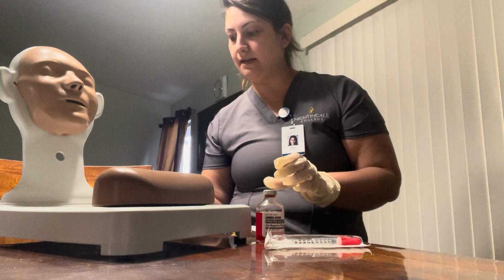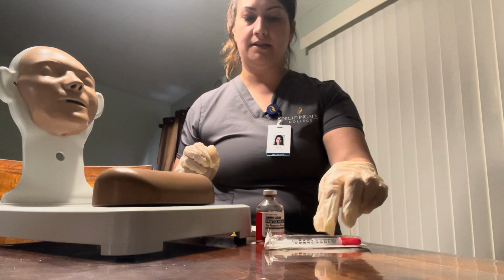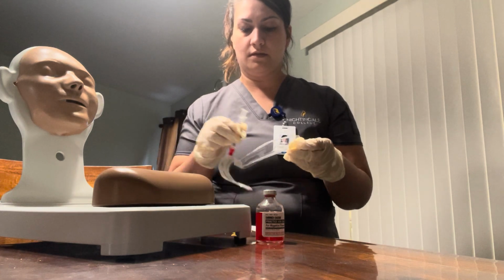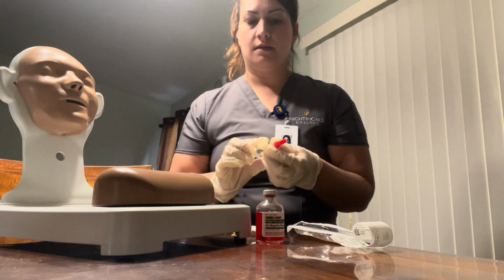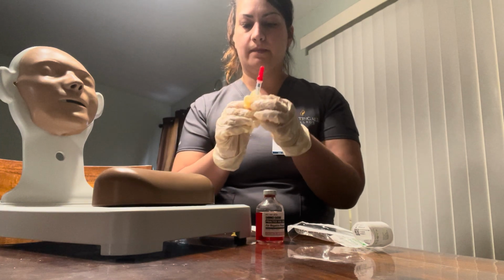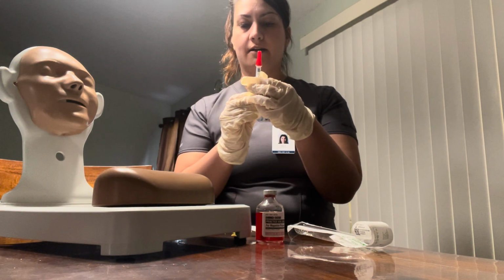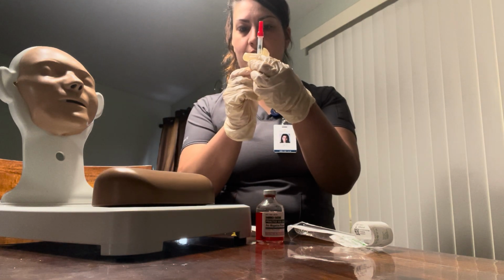I will discard this. All right, next I'm going to open up my syringe. And I'm gonna hold it like a pencil. And we will put in the air of 1 milliliter for a patient. So I'm gonna put in 1 milliliter of air.